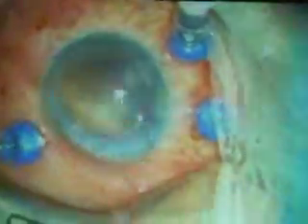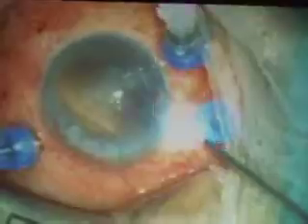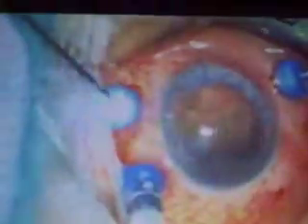So I think that these valves are very advantageous. Also, when you do scleral indentation, do not increase the level of the perfluorocarbon to the level of the break, except when you have achieved complete relief of traction. Because once there is traction, you will get PFCL under the retina.